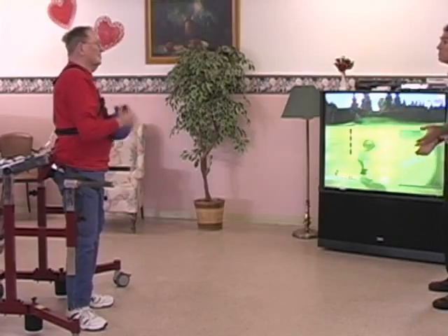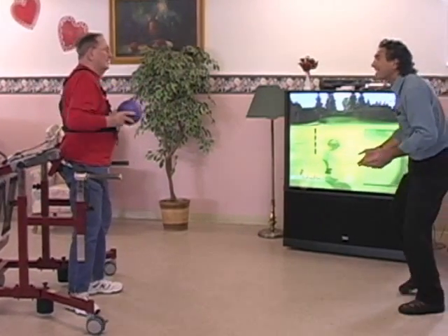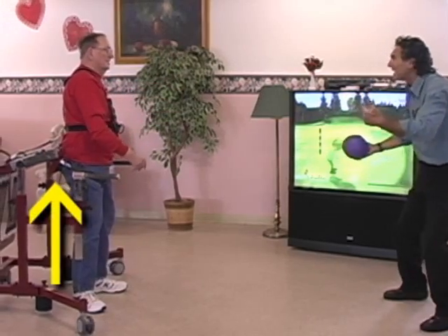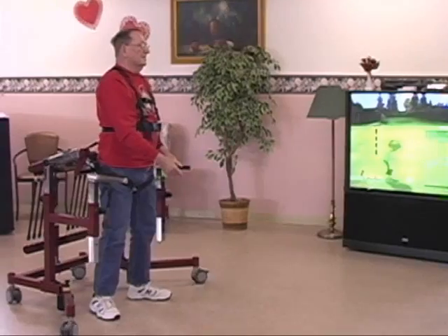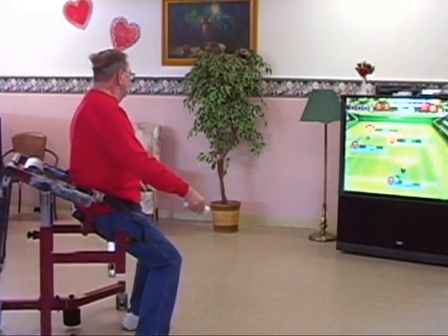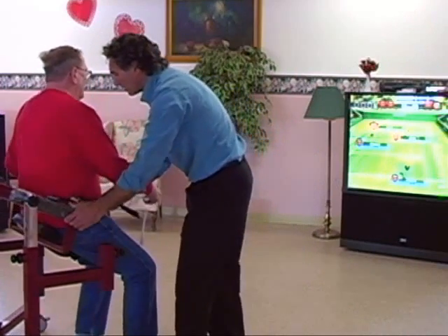The Bungie Mobility Trainer employs a unique body weight support technique that provides support from underneath rather than the conventional hanging support method from above. This important difference allows for more natural practice of protective sidestepping and righting reflexes.